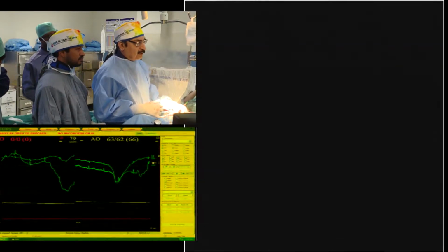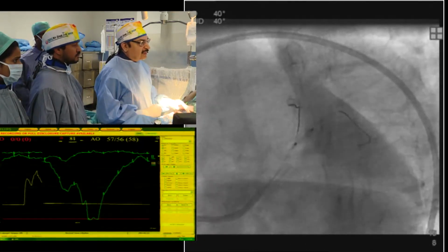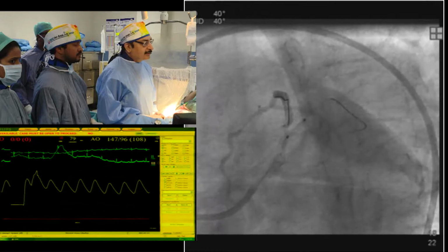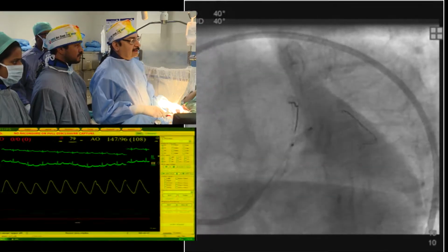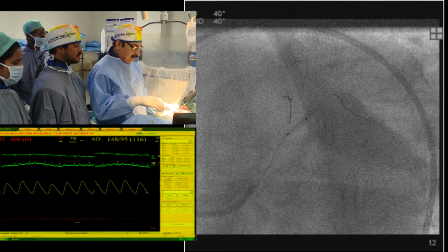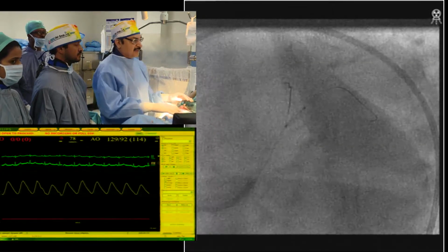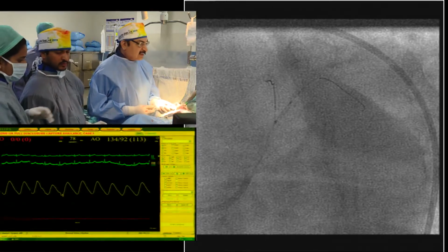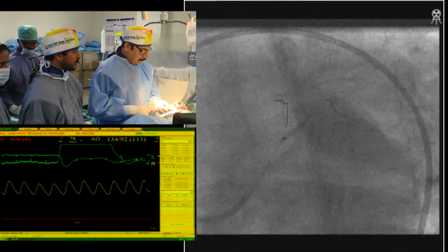we used a very low, just a 2 millimeter at a low pressure. So we are with the cutting balloon 2.25, starting from the ostium of the diagonal, and we have tried to spare as much of the LAD as possible, and then we'll be there for about 10-15 seconds. What is the maximum? It's 12, sir. 12 is 2.4. Rated RBP.